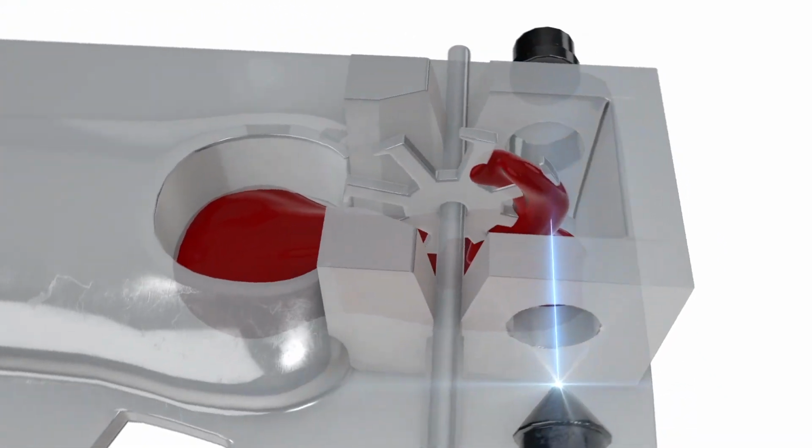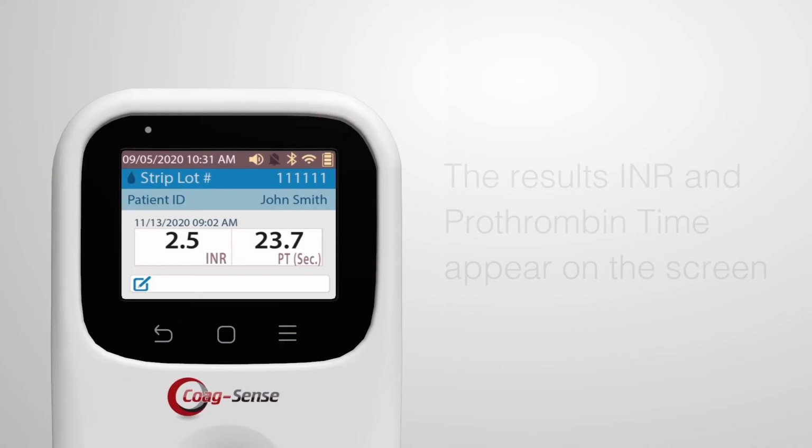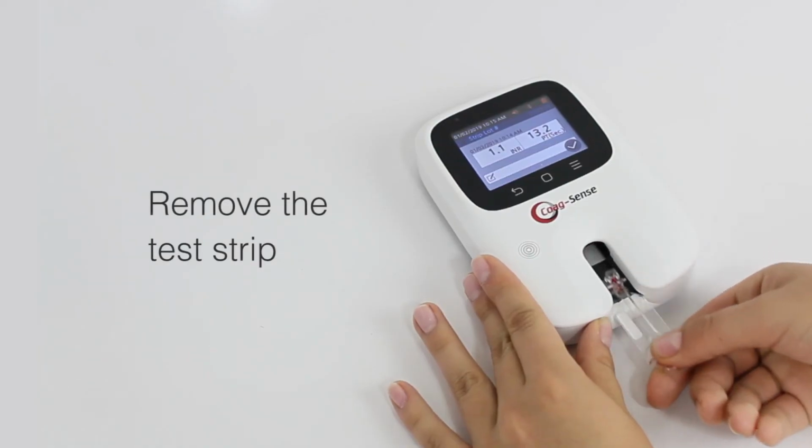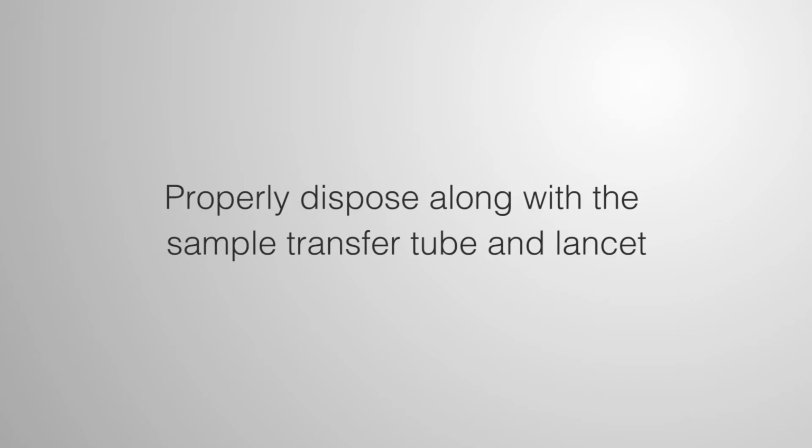When testing is complete, the meter beeps once and the results, INR and prothrombin time, appear on the screen. Remove the test strip and properly dispose of it along with the sample transfer tube and lancet.